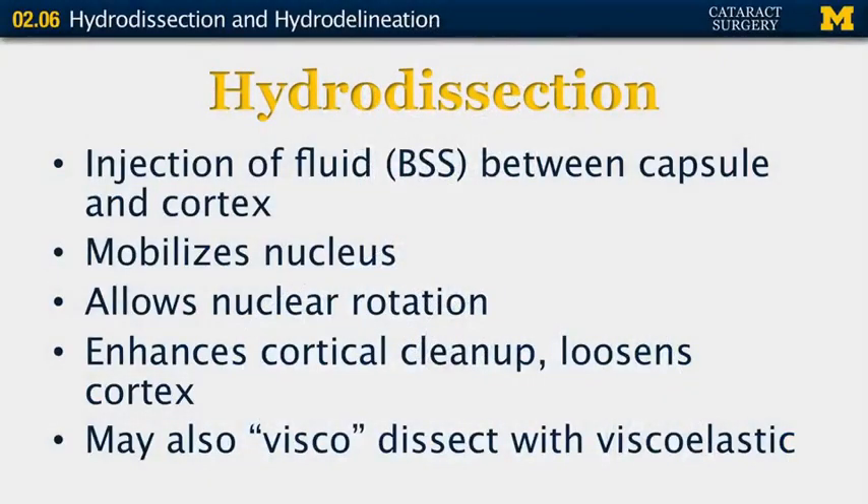Hydrodissection is the injection of fluid between the capsule and the cortex of the lens. Its purpose is to mobilize the nucleus so that the nucleus can be rotated and to enhance cortical cleanup by loosening the cortex from the capsule.